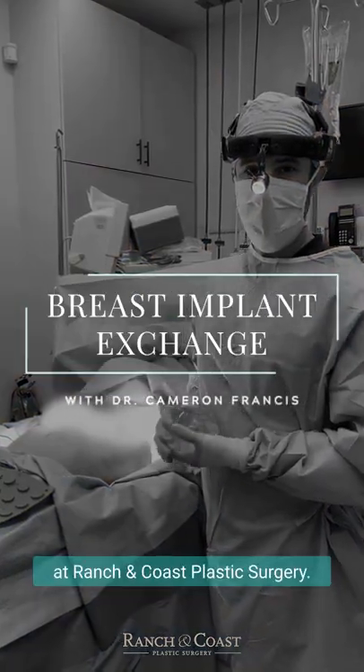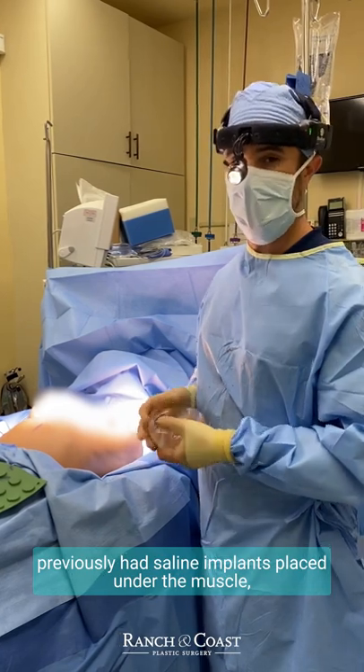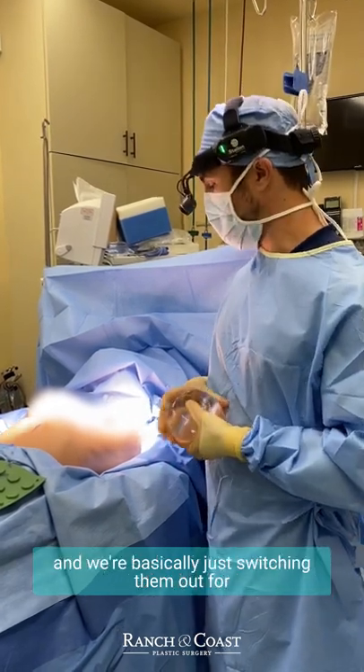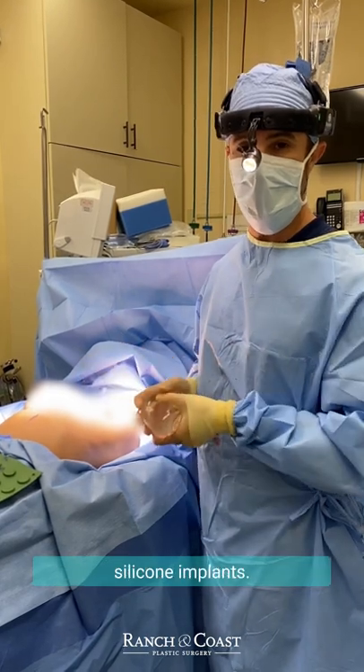Hi, it's Dr. Francis at Rancho Coast Plastic Surgery. We're here with a 39-year-old patient who previously had saline implants placed under the muscle, and we're basically just switching them out for a little bit bigger, a little bit fuller silicone implants.